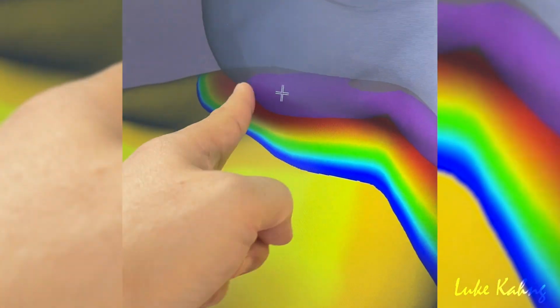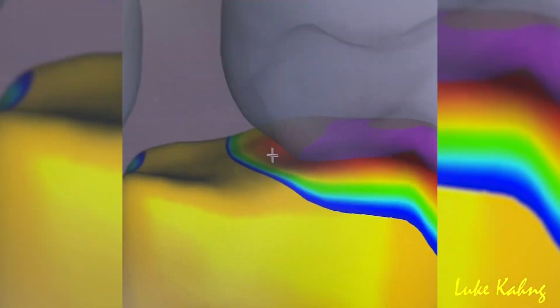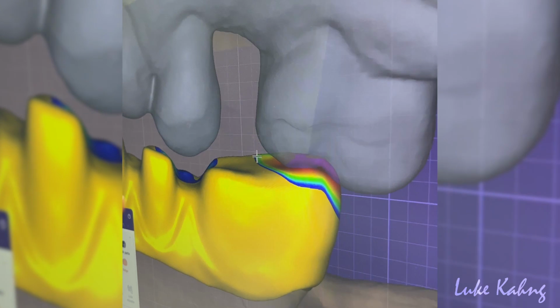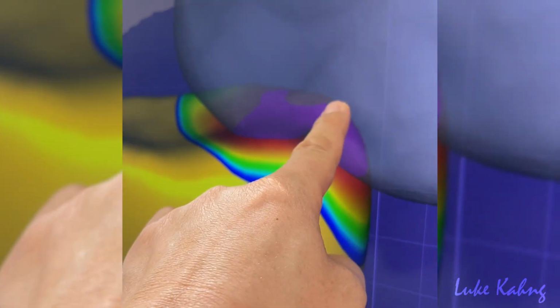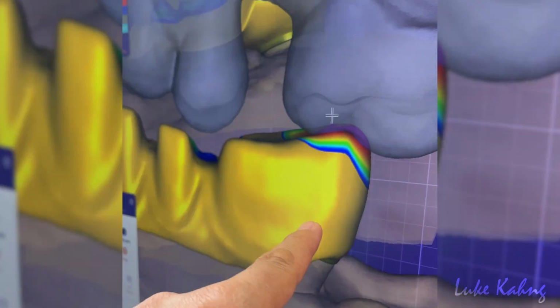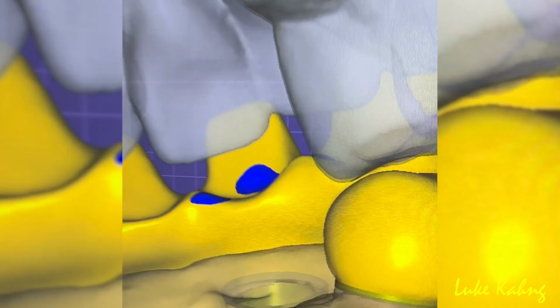Because they were touching, I'm going to make an indentation between them, so you can step down just like this eventually. Then I can make the 4-unit bridge slightly open. We're going to open the occlusion contact as well. That was metal, it will be touching, and there will be open zirconia crown. Okay, the other one has room, this one is slightly tight, so possibly we're going to grind the opposing as well, especially on the other side.